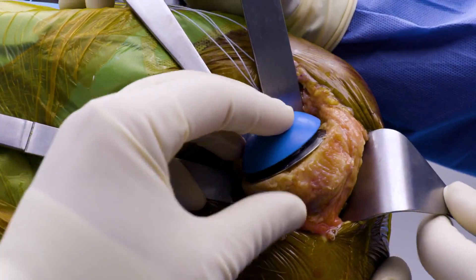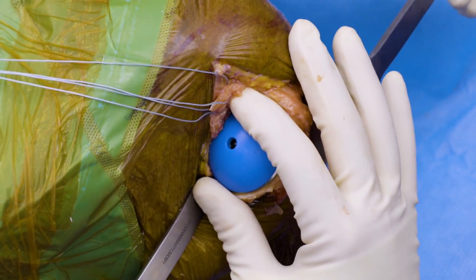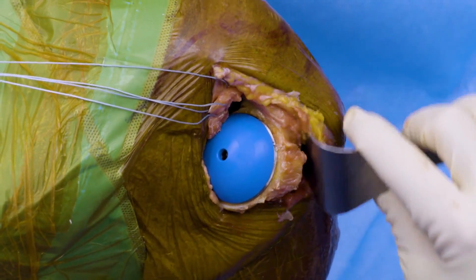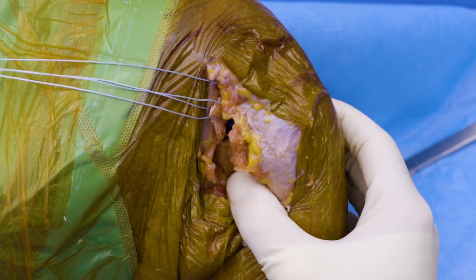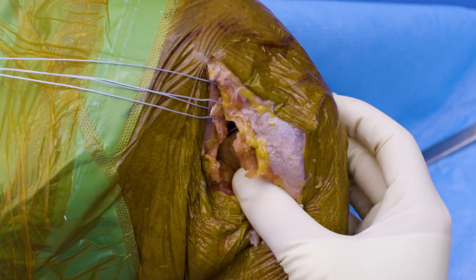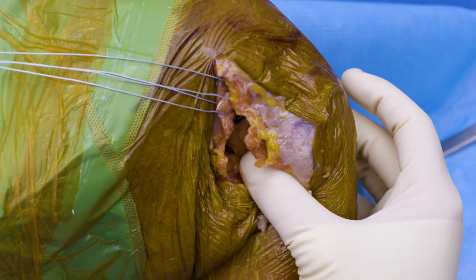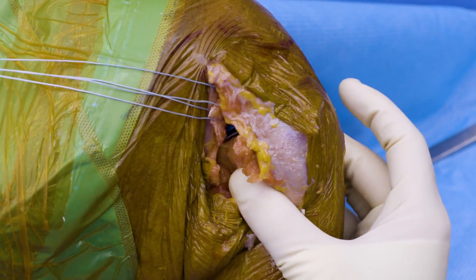Once we've applied our trial head, we're going to remove all of our retractors. We're going to internally rotate. My goal is to have approximately 50% posterior subluxation of our humeral head on our glenoid. We don't want it snapping over the back and just recentering right into the middle.